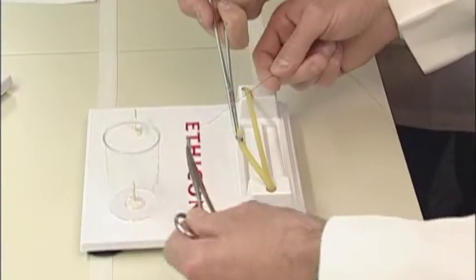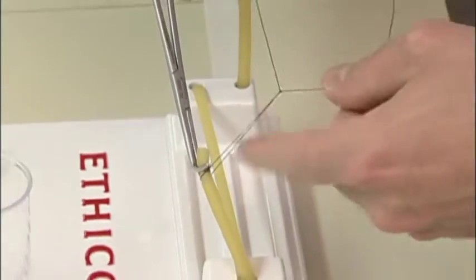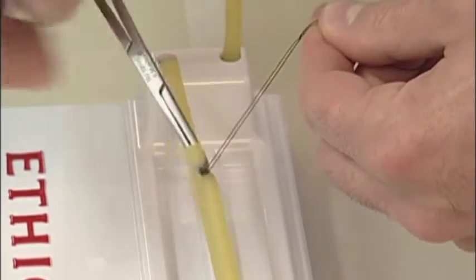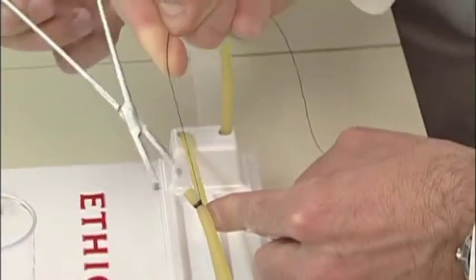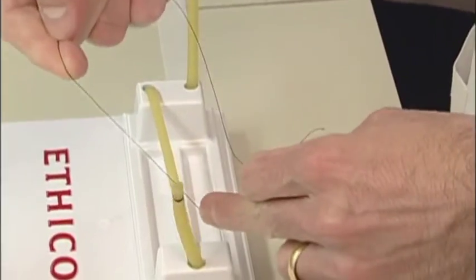The time will start when I'm ready, and then the next step is to pass the clamp around the tubing, and then to start forming your first knot. Make sure that the assistant holds the clamp such that it is easy for you to see the black target line as shown here. And then we want to tie that first knot down. When I'm holding tension I will say "off," and that lets my assistant know to take the clamp off, and then I will tie down 2 additional square knots as shown here, and then the time stops.